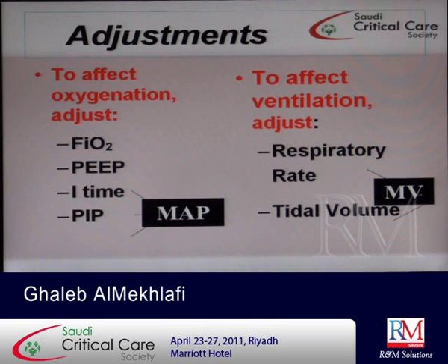some ventilators. If the problem is accumulation of CO2, like in type 2 respiratory failure, and the oxygen is okay, then we will play only with the rate and the tidal volume. Clear, this is very important, you have to keep it in mind. If the problem is hypoxemic, don't increase the rate, he will not benefit from the rate. Okay. If the problem is CO2, don't increase the FiO2, he will not benefit, he will get even more worse CO2 retention. Okay, you got this point.